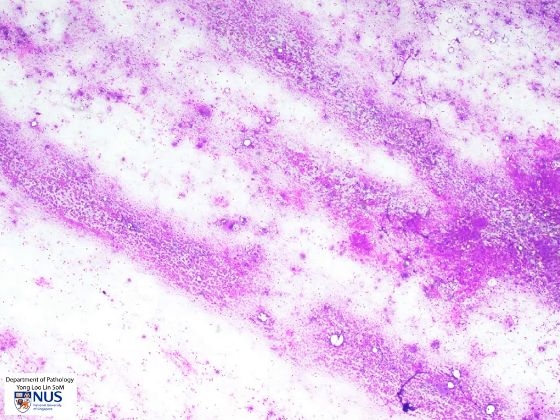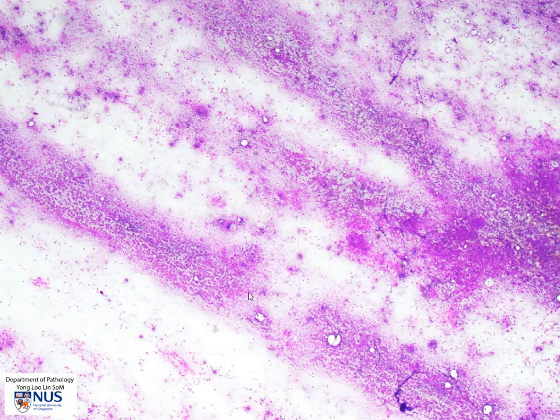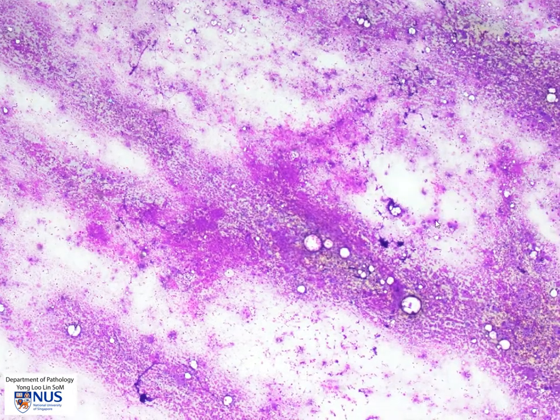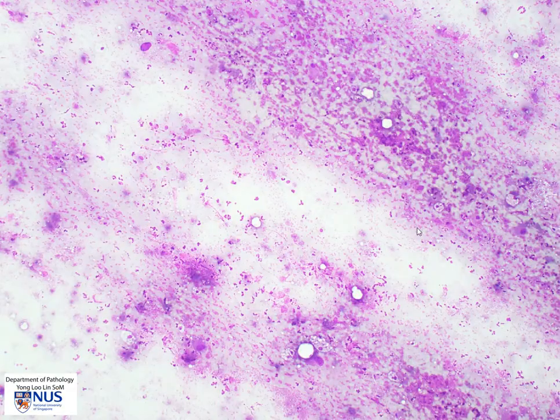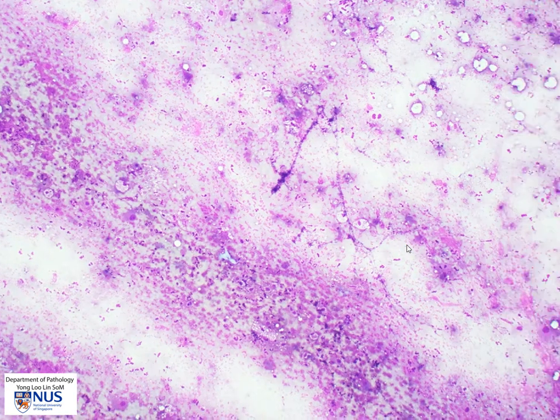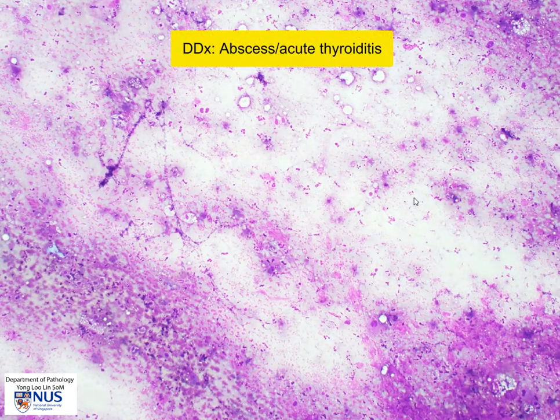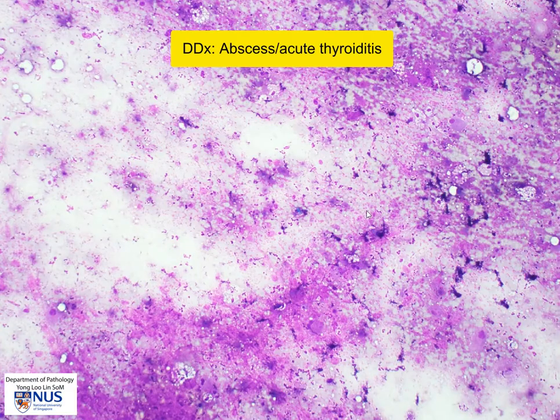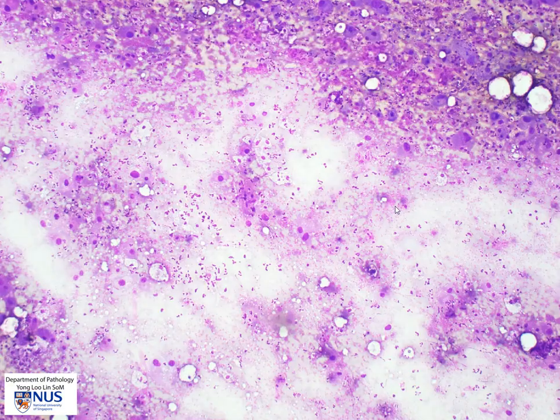Here is an air dried smear from another case and we can see that at low magnification there seems to be some inflammatory cells in the background. We start to then see these abnormal larger cells, but there are quite a lot of neutrophils in the background. Sometimes these tumors can almost look like an acute inflammatory process with only very sparse malignant cells. So we always have to look very carefully at the entire smear to make sure that there aren't tumor cells like these dotted throughout the inflammatory areas.